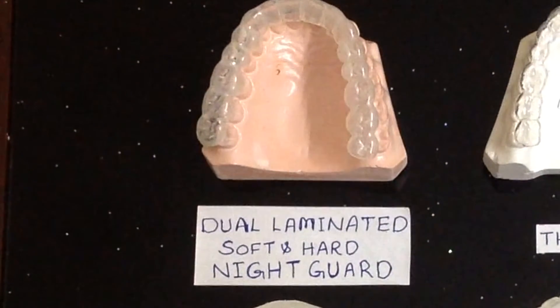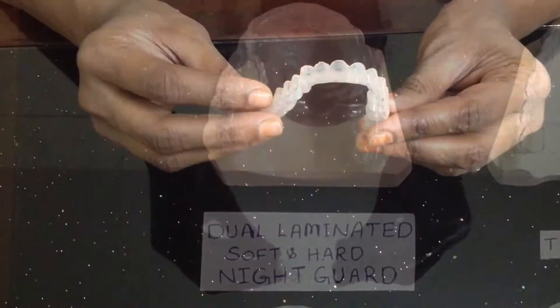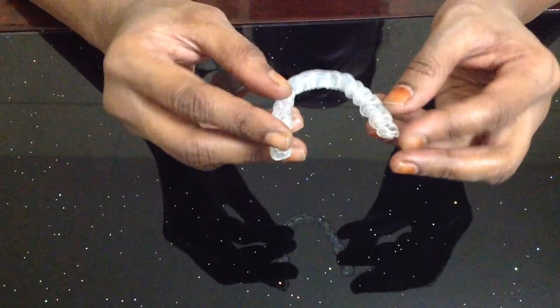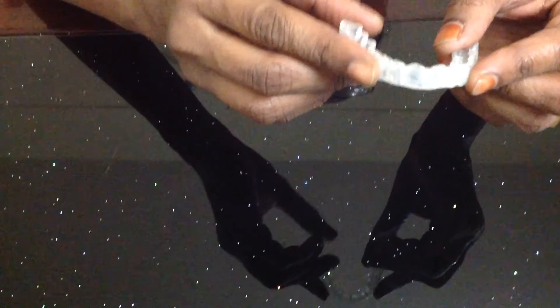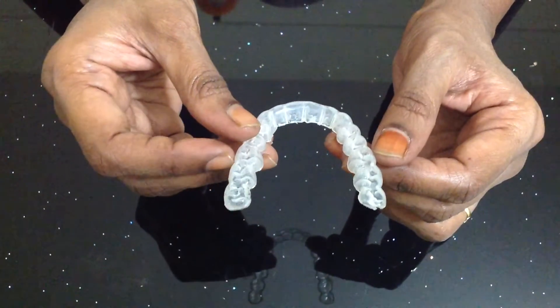The third is our most popular dual laminated hard and soft nightguard, designed for patients suffering from heavy bruxism. Indication: this guard is designed for heavy grinding and night clenching. If your patient is a heavy grinder, opt for a minimum 3 mm thick dual laminated extremely dense material nightguard.